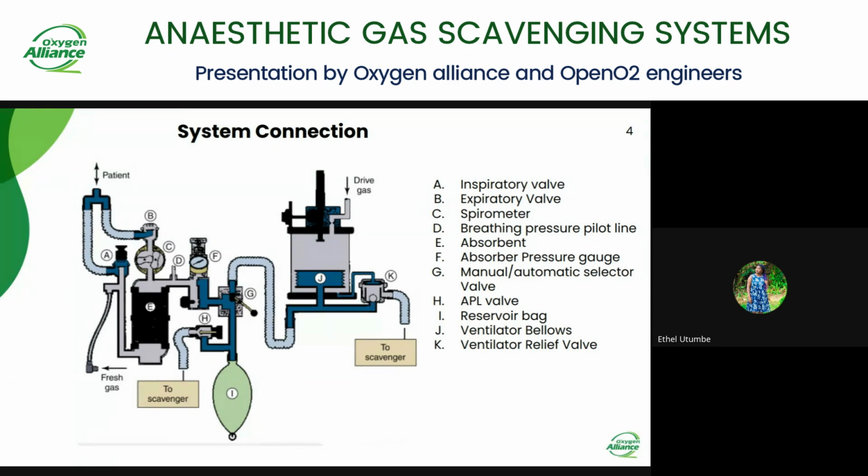This is how the system is connected from the anesthesia machine to the scavenging system. As you can see, this whole diagram is explaining the anesthesia machine, and then as you can see, below is written "to the scavenger."